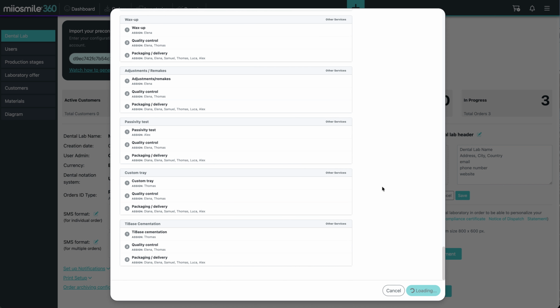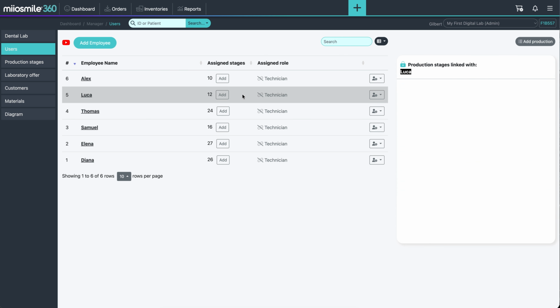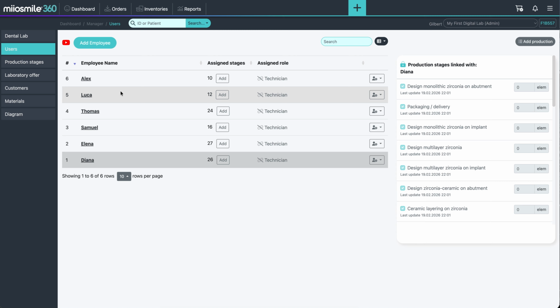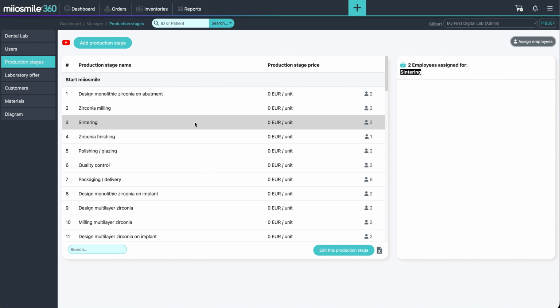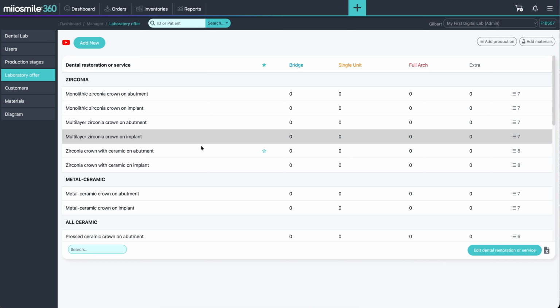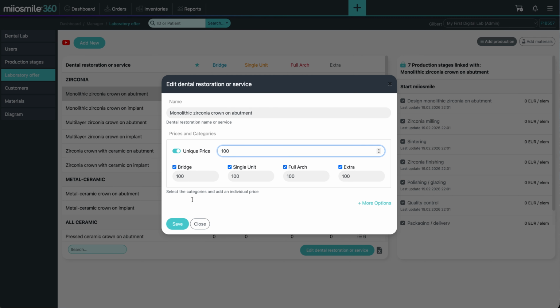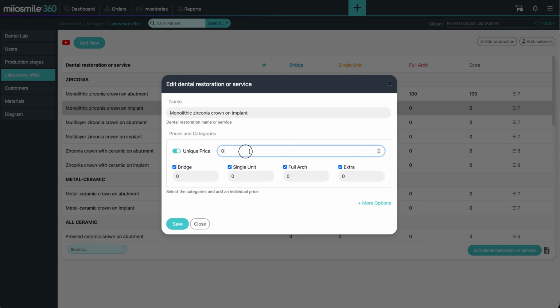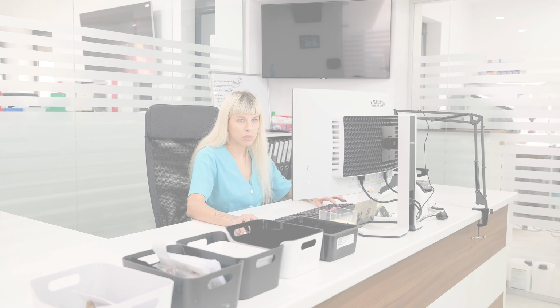The purpose of this process is simple: to help you start using the platform from day one without spending hours on manual setup. And of course, everything remains fully customizable. You can add new products, define pricing for each item, and even set preferential pricing for individual clients. Complete flexibility, full control. You can immediately begin registering and managing cases.